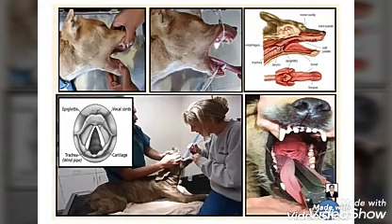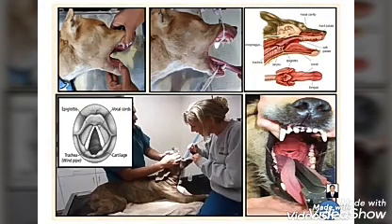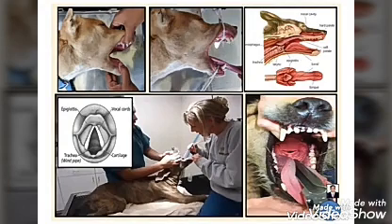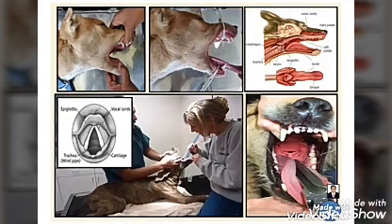So after shifting the animal to either sternal or lateral recumbency, the retainer should fully extend the upper and lower jaw using cotton strings and pull the tongue in the downward direction for better visualization of the laryngeal region. Do not push the neck of the animal in the ventral direction, which obscures the laryngeal anatomy.